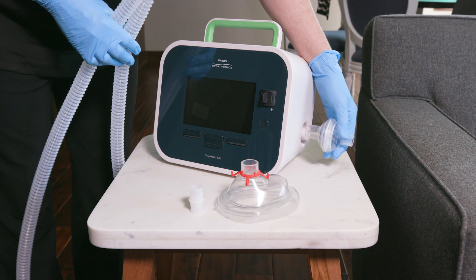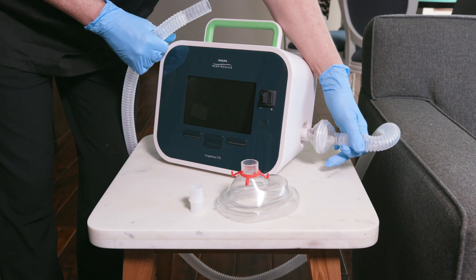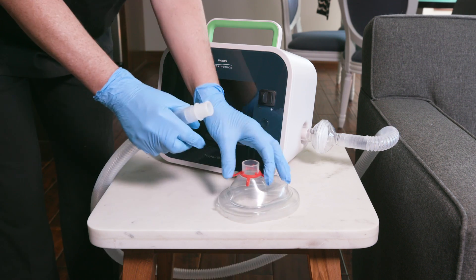Starting at the cough assist device, assemble the filter, corrugated tubing, adapter, and patient interface.